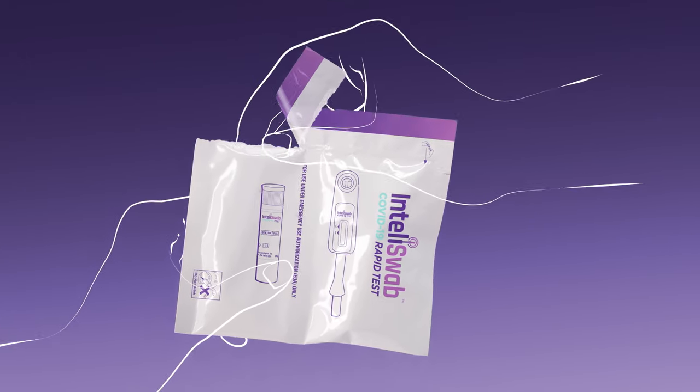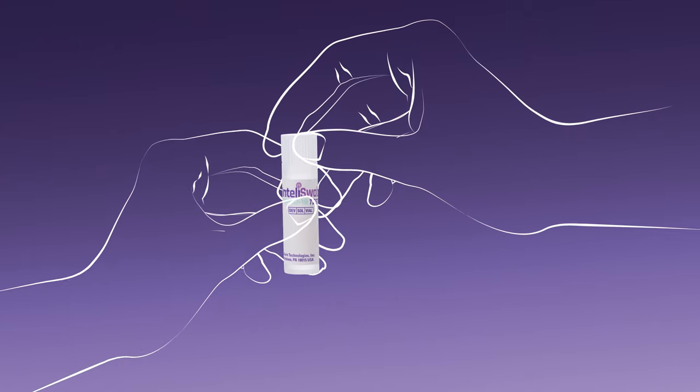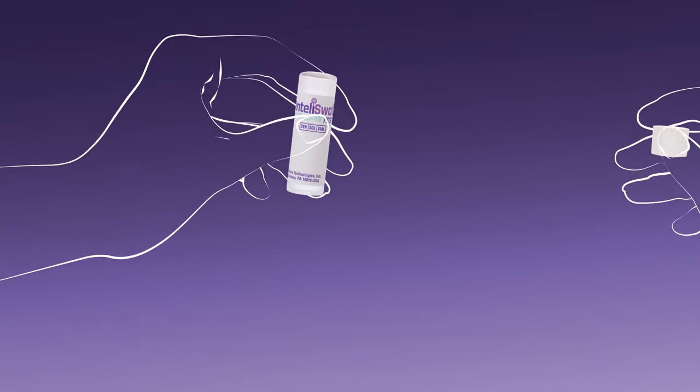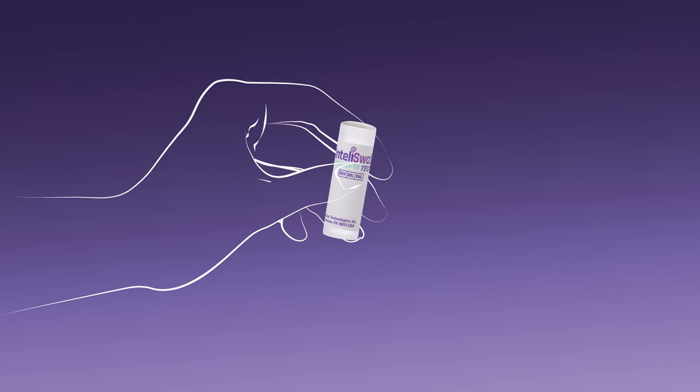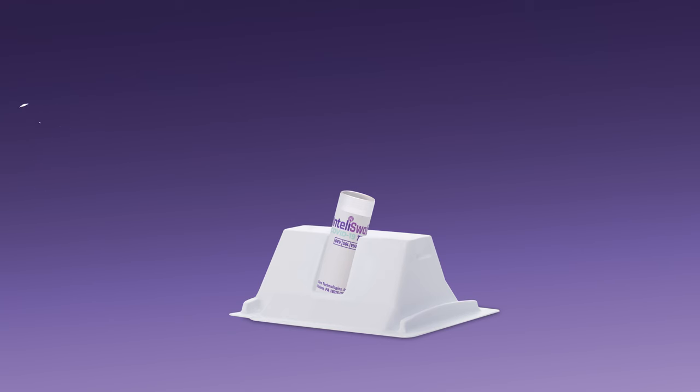Pick up one of the two-part pouches. Tear open the pouch containing the tube, remove it, hold it upright, then gently take the cap off by rocking it back and forth. Do not twist and do not pour out the liquid. Slide the tube into the test stand and let it rest at an angle as shown.